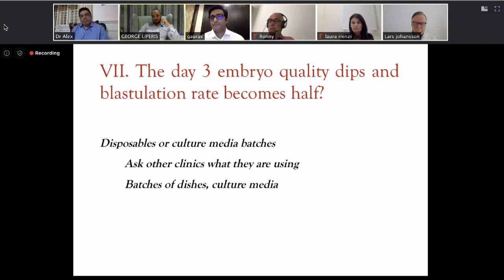I think one additional thing to look at when it comes to culture media is exposure to temperature, sun rays and UVs. Some labs might have windows and think it is a good idea to get some sunshine, but that's not a good thing for the creation of reactive oxygen species, dysregulation of calcium and depletion of antioxidants in the culture medium. So also pay careful attention to the media, looking at expiry dates, whether there is any precipitation, whether the media is cloudy.